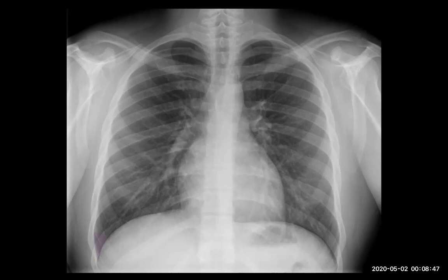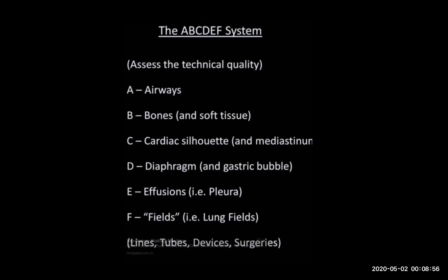This is the frontal radiograph. We pass through the ABCDEF system according to our practical sessions. We have A for airway, B for bones and soft tissue, C for cardiac silhouette and mediastinum, D for diaphragm — right hemidiaphragm and left hemidiaphragm — and gastric bubble assessment, which is located on the left side, for assessment of pleural effusion and the lung fields.